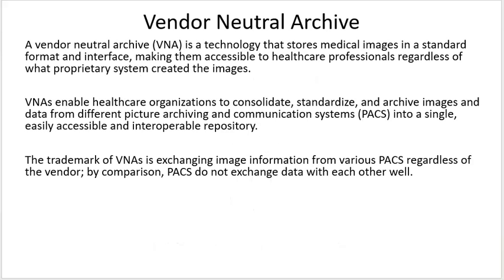Of course, there is the VNA, the Vendor Neutral Archive. It's a technology that stores medical images in a standard format and interface, making them accessible to healthcare professionals regardless of what proprietary system created those images. So if you have a large enterprise and you have multiple PACS systems, let's say you have a 5-hospital system, and one hospital uses McKesson PACS, one uses Fuji PACS, and another uses Philips PACS. All of those PACS systems are not going to talk well to each other. They're not going to be able to exchange data without a lot of customization and a lot of work on the part of the PACS administrator.